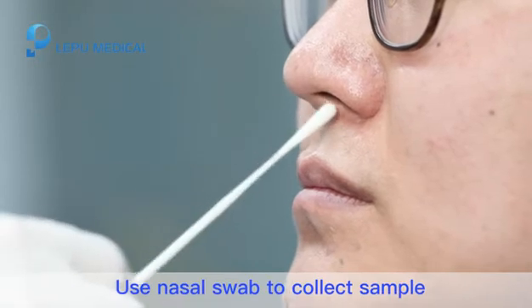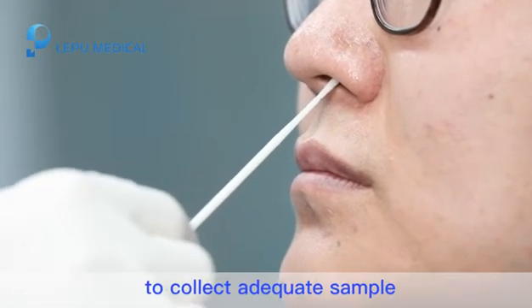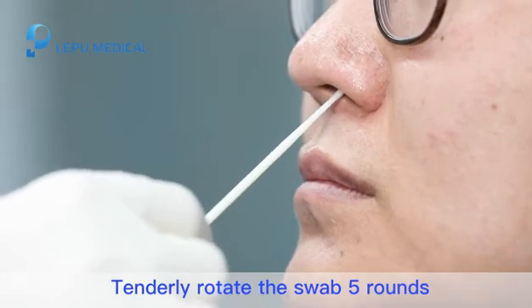Step 3. Use a nasal swab to collect a sample. The swab should go down to the nasopharynx to collect an adequate sample. Tenderly rotate the swab 5 rounds.